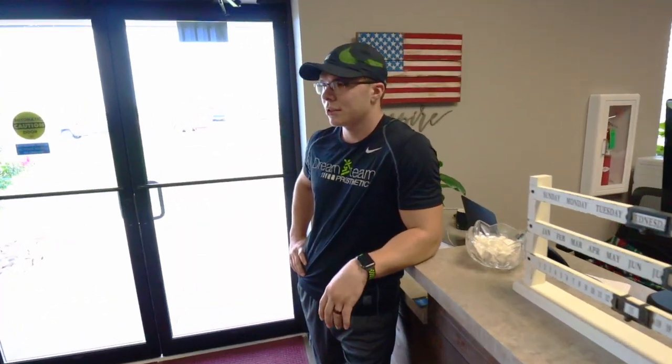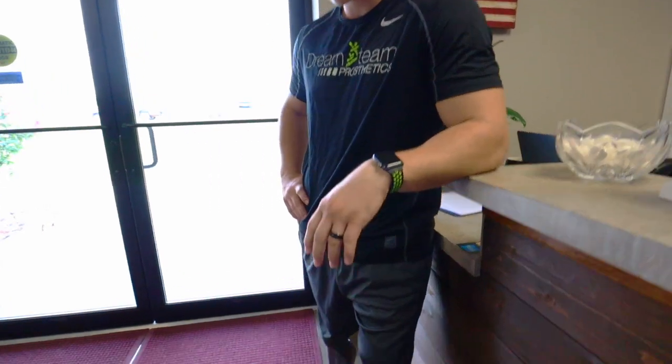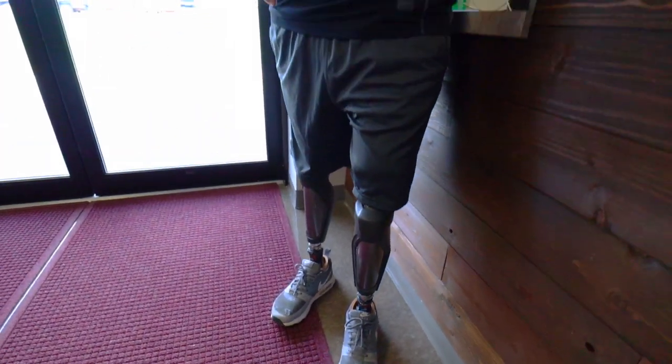Hello everyone, Seth Alexander here. We are live at Dream Team Prosthetics in Duncan, Oklahoma. I'm wearing some C-Leg 4s today and I'm gonna go over how to sit down and stand up out of a chair.